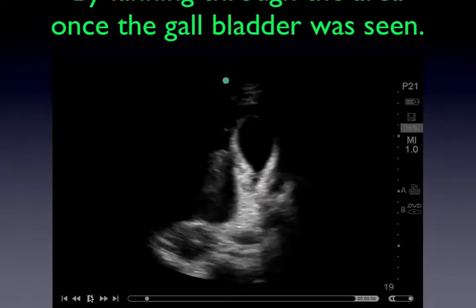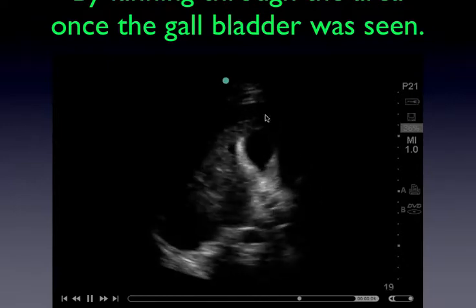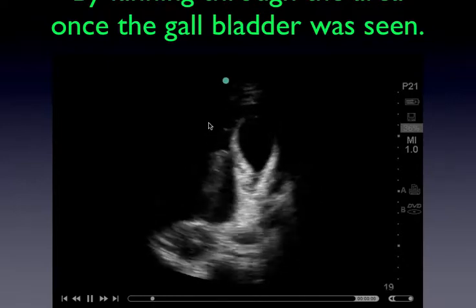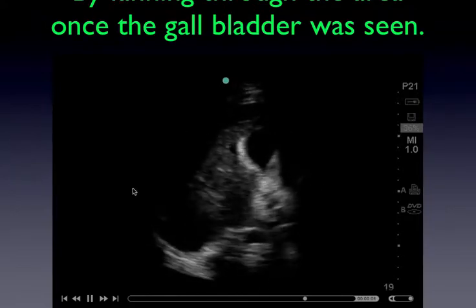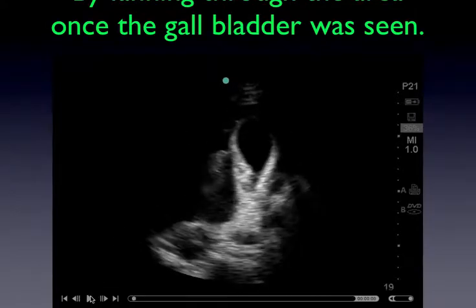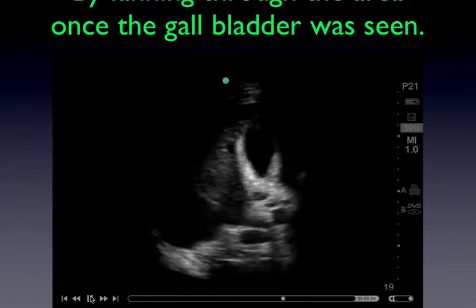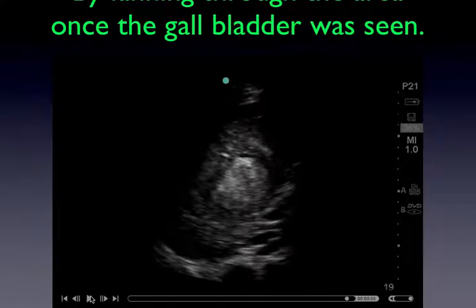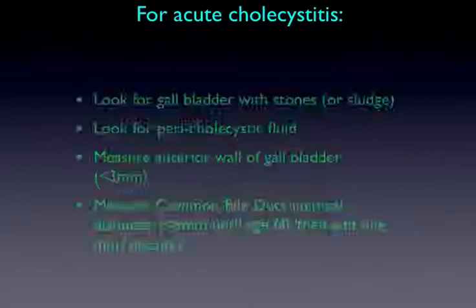There's a reason why this patient has a thickened gallbladder, and that's due to the ascites, which we can see here. And there's a reason why this patient has ascites, and that's not due to his gallbladder disease. That's due to the liver cancer, which was proven by biopsy of this mass, actually, not a nodule.